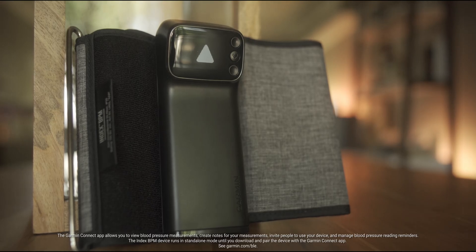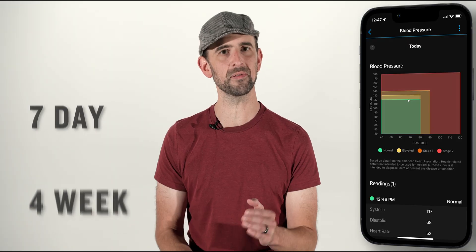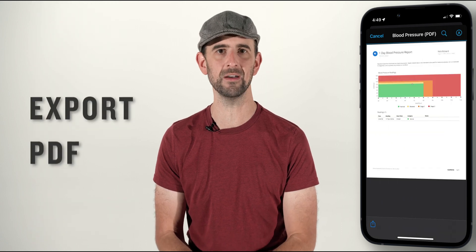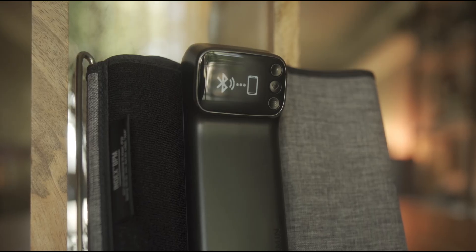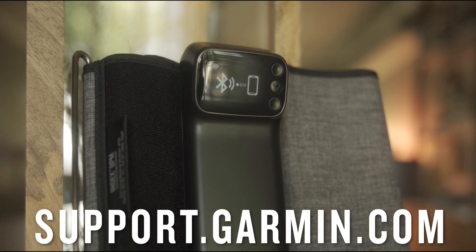In the case you're working with your healthcare provider to manage your blood pressure, easily create and view seven-day, four-week, and one-year reports in the app and export them to a PDF that can be shared via email or in person. For more instruction on setting up the app for use with this monitor, please visit support.garmin.com.